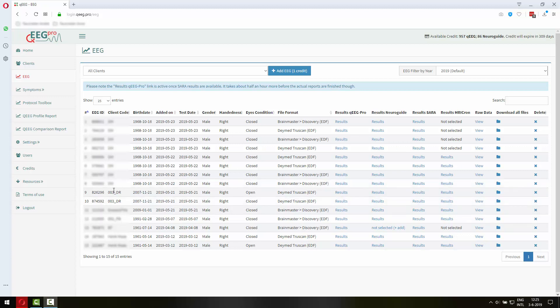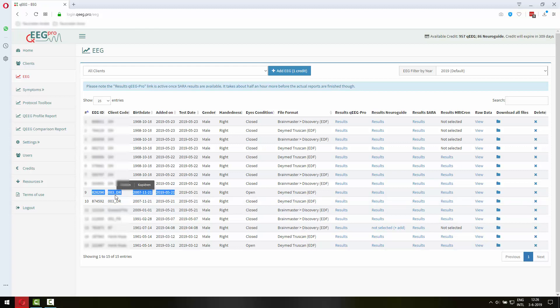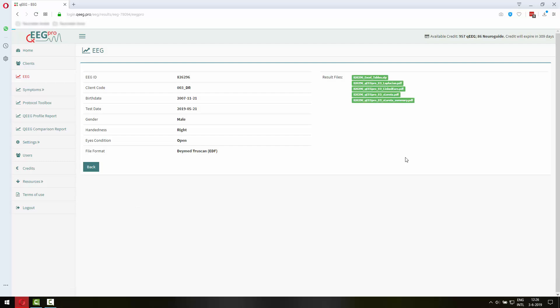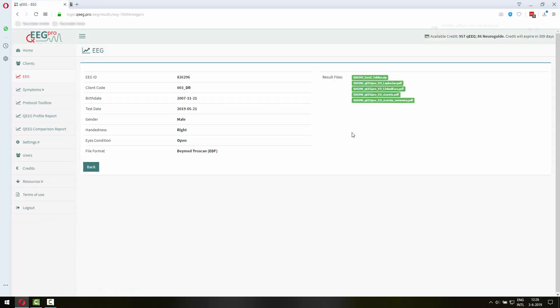So here I have the EEG results, the maps of different clients and I will focus on this client 003 underscore DR. That's going to be the client for which I have requested a protocol recommendation. So let's quickly look at the results of this client.